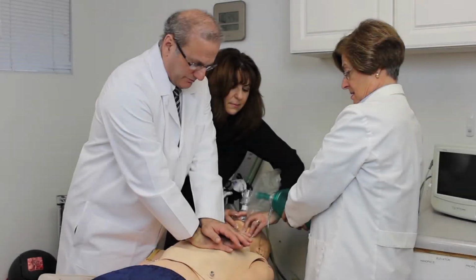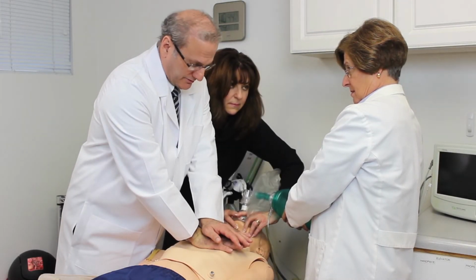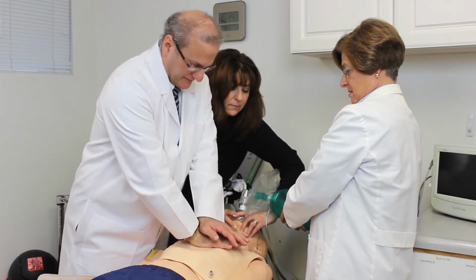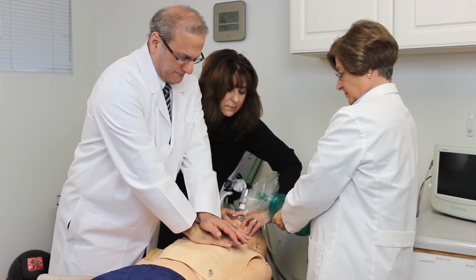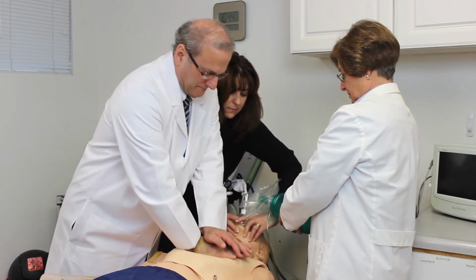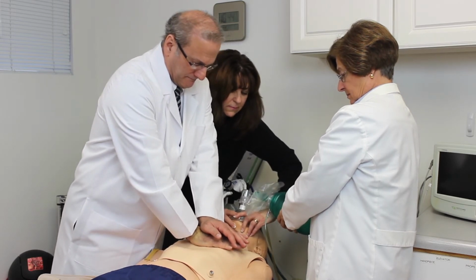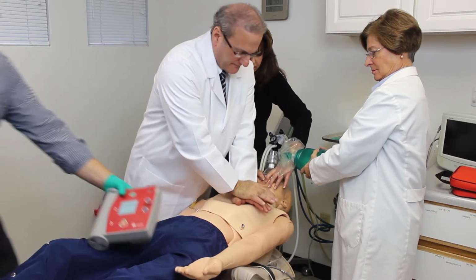We've switched to the mannequin to demonstrate CPR. We have one group managing the airway with the bag valve mask. We highly recommend the two-handed technique with an extra person squeezing the bag. We want to do chest compressions at the rate of 100 per minute, and we want to do compressions at a rate of 30 per every 2 breaths. Let's also set up the AED.